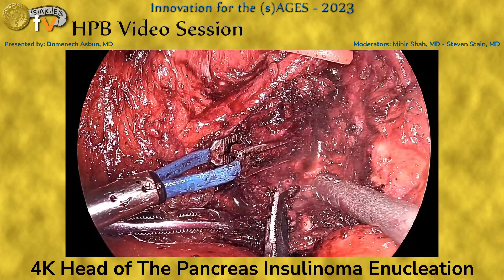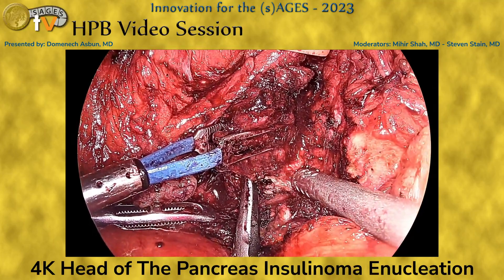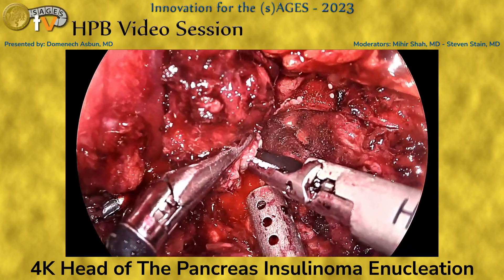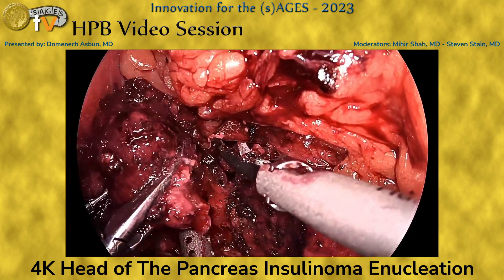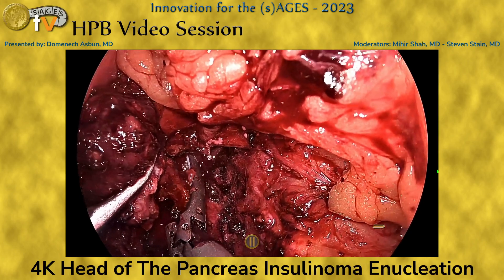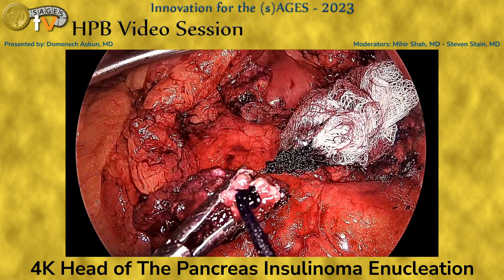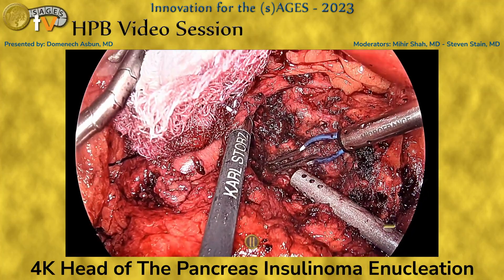Here we continue with a patient and tedious dissection. And that is the insulinoma. We mark it inside the abdomen, as it's pretty easy to get disoriented once the specimen is removed from the abdomen.